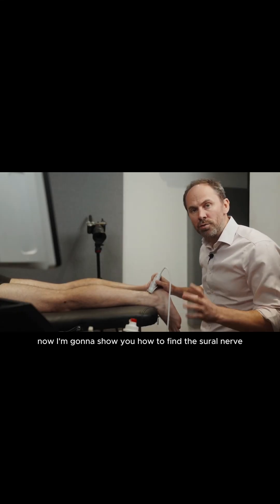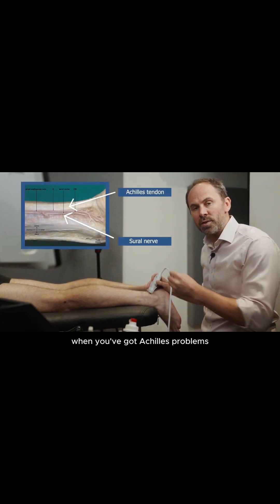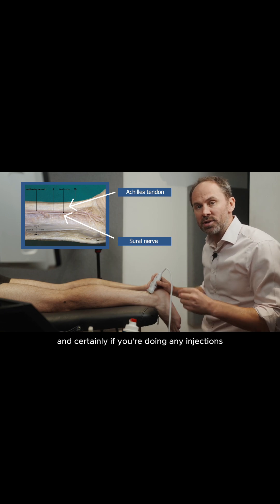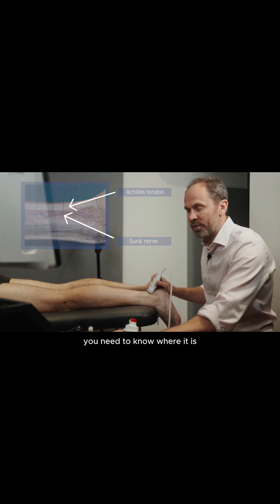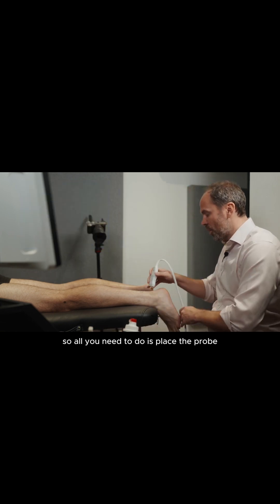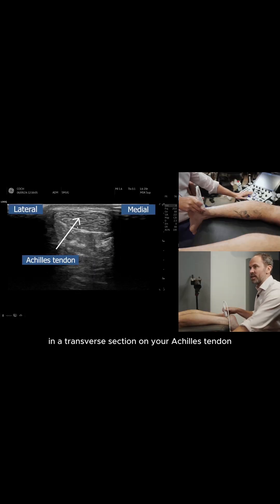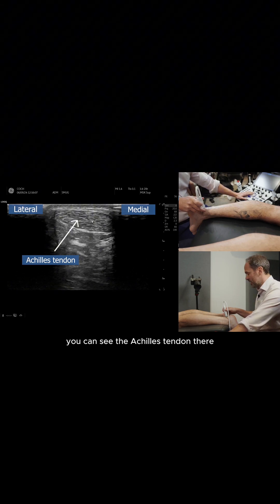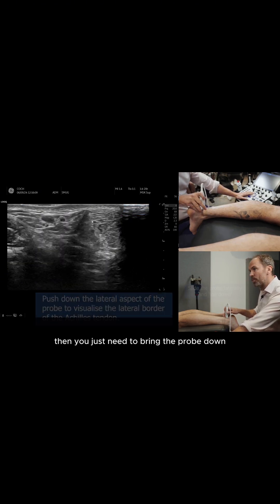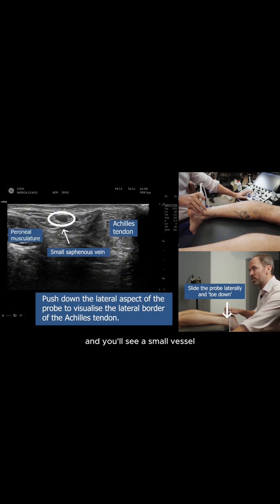Now I'm going to show you how to find the sural nerve, and this could be a differential diagnosis when you've got Achilles problems. Certainly if you're doing any injections you need to know where it is. All you need to do is place the probe in a transverse section on your Achilles tendon — you can see the Achilles tendon there — then just bring the probe down and you'll see a small vessel.